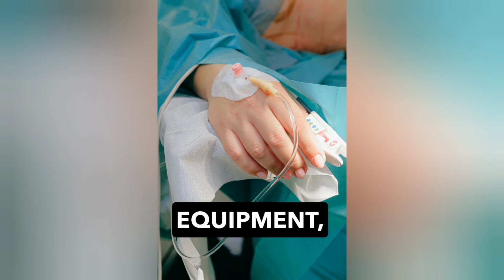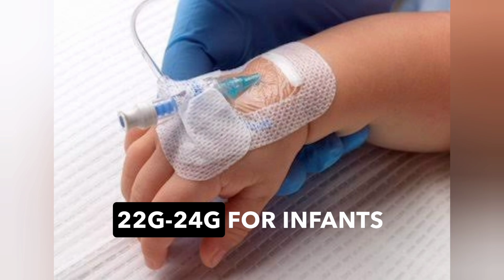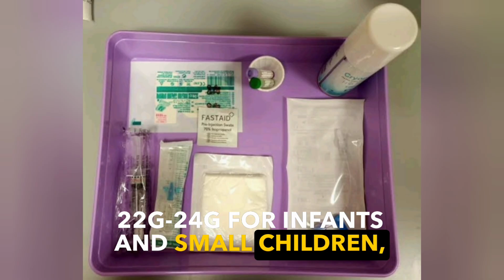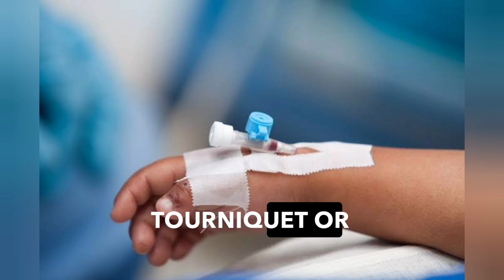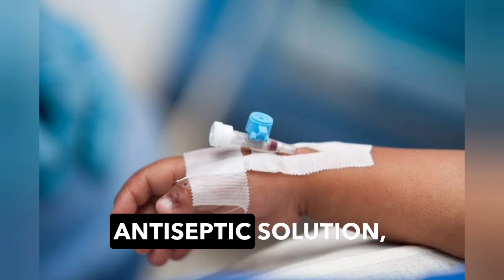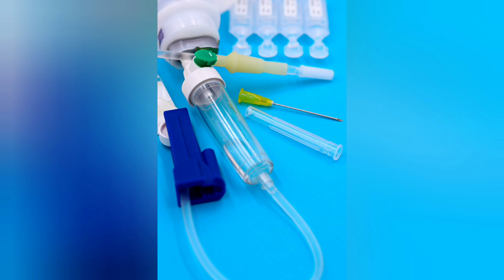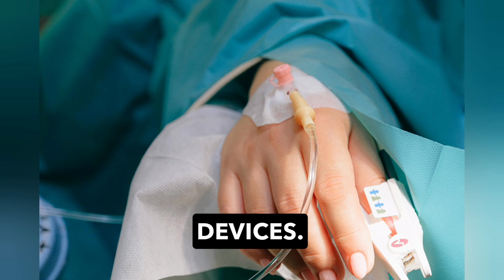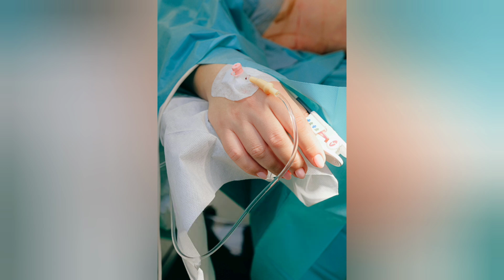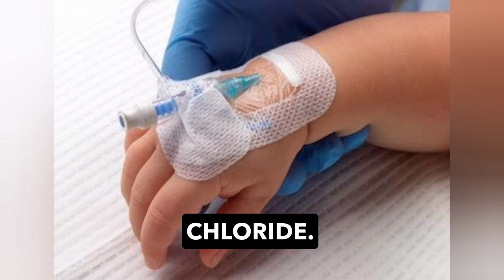3. Equipment. Cannula, appropriate size: 22G to 24G for infants and small children, 20G to 22G for older children. Tourniquet or elastic band. Antiseptic solution, for example, chlorhexidine or alcohol swabs. Sterile gloves. Adhesive tape or securement devices. Transparent dressing. Saline flush, 0.9% sodium chloride.